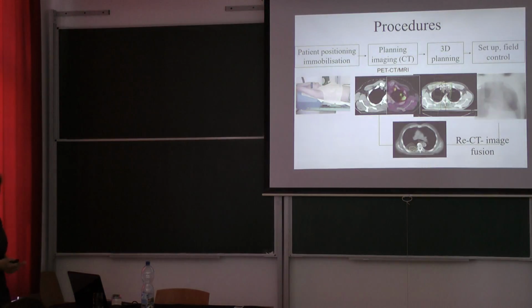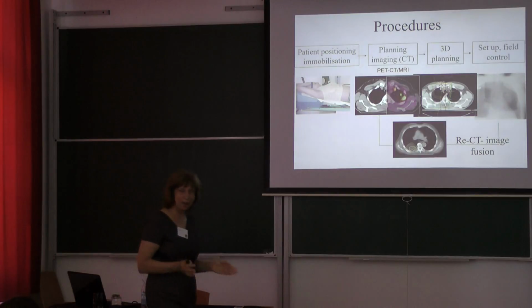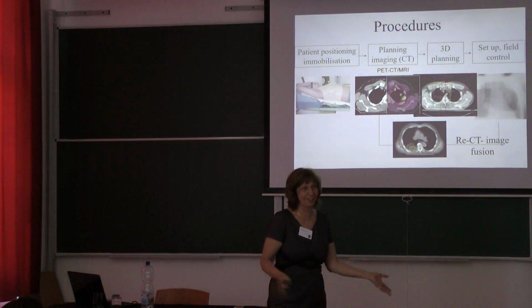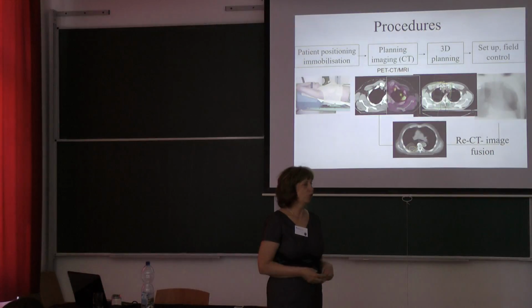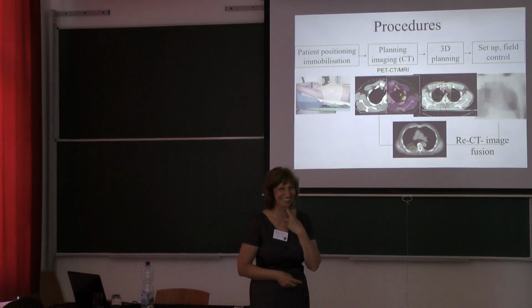All of these very selective radiotherapy needs special procedures, because we have to make a geometrical object from the patient first. Because if she is not laying down during the fractionated radiation, do you remember what was the conventional fractionation size? Fraction size.